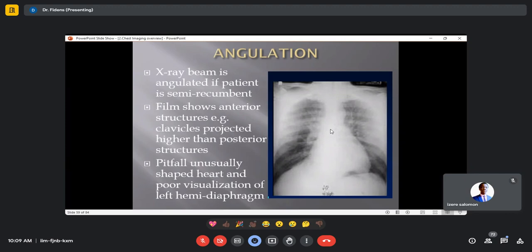So when you see this, don't start thinking of any disease. But what you can do, if you are not able to analyze it, is it's better to repeat it, and you just ignore the irradiation. The reason for this X-ray was to diagnose any disease.